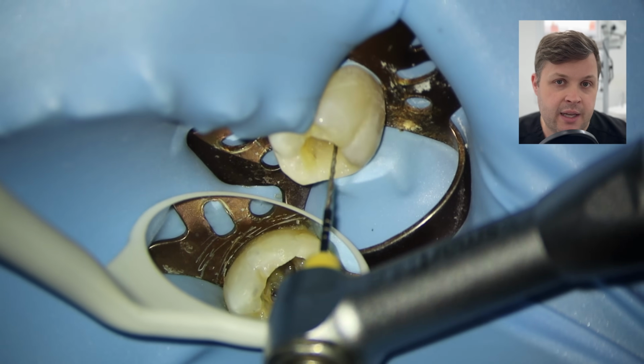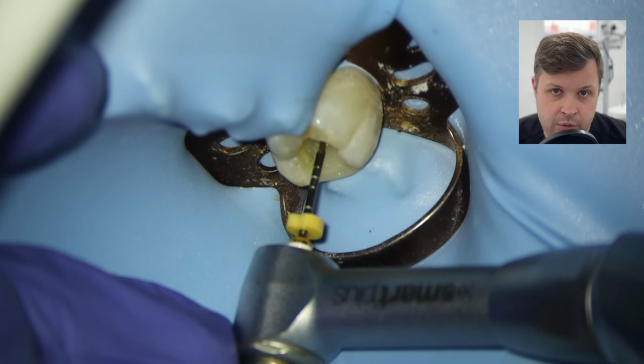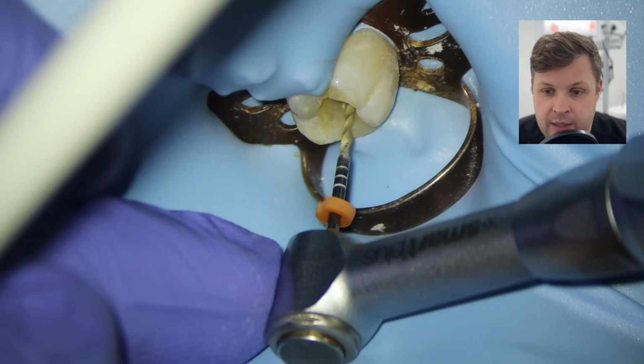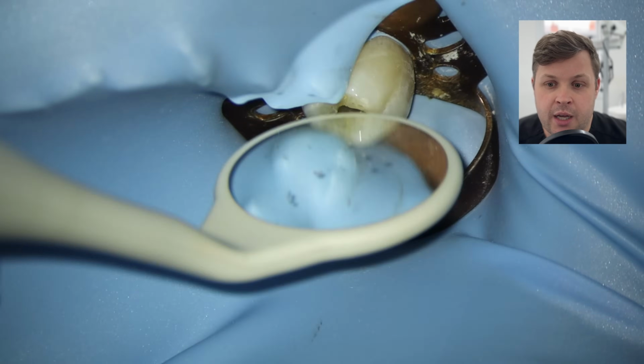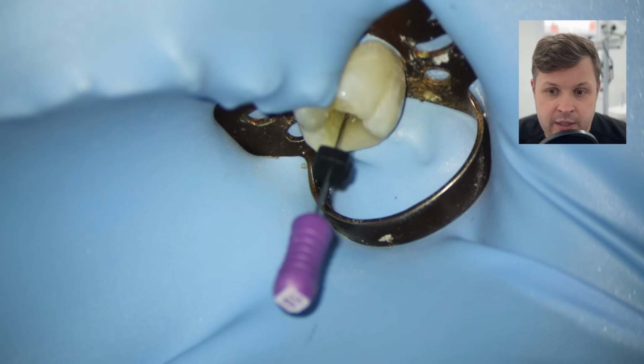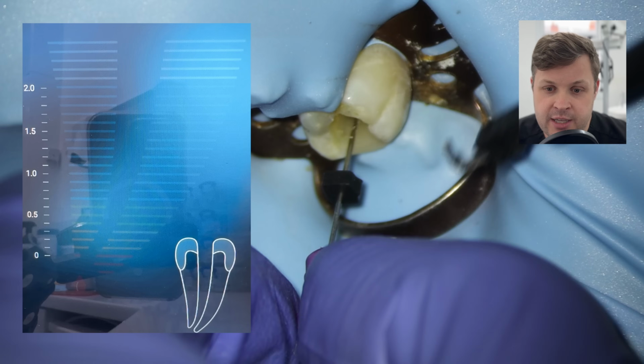We're going to use a glide path file just to shape up this coronal third, and then we're going to use a size 25 variable high flex file to further open it up. And I'm going to use this length 31 size 10K file then just to reach the apex of this tooth.